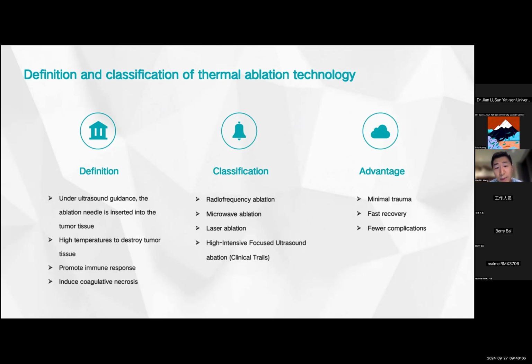Now normally we use radiofrequency ablation, microwave ablation, and laser ablation. In recent years, we also use high-intensity focused ultrasound ablation in clinical trials. Right now, in our center, we are carrying out this method. The advantages of thermal ablation technology are minimal trauma, fast recovery, and fewer complications.